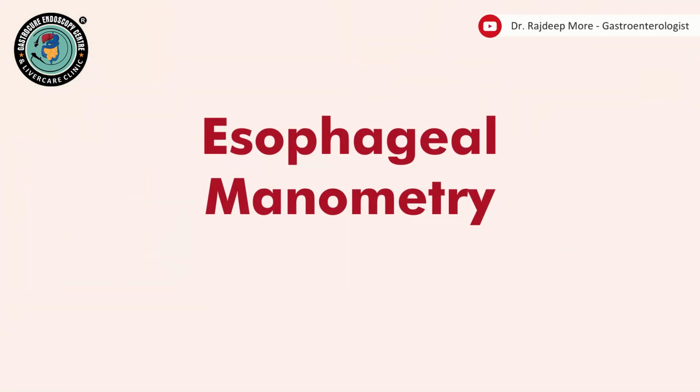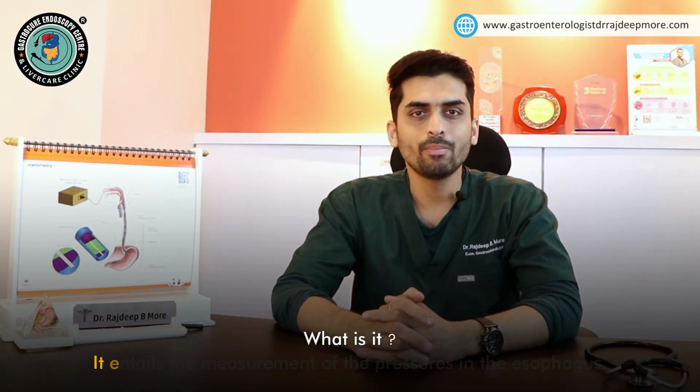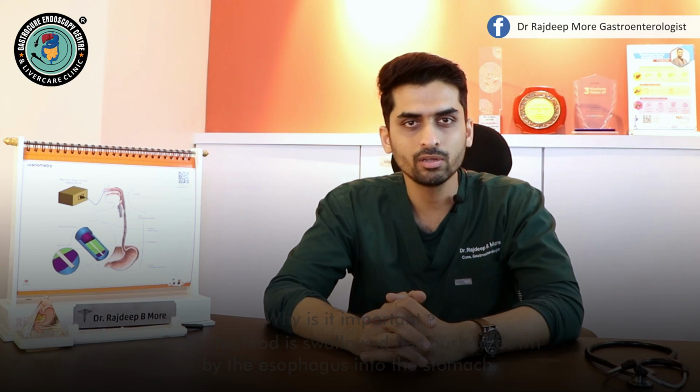Today we'll be talking about a specialized test called esophageal manometry. Now what exactly is esophageal manometry? So manometry entails the measurement of the pressures in the esophagus. Now why is it important?